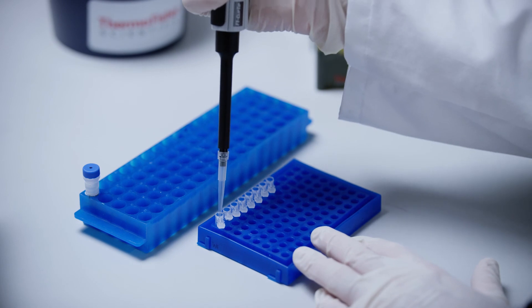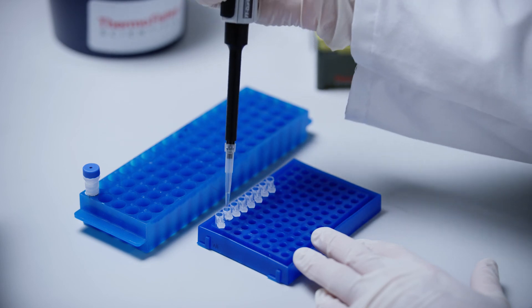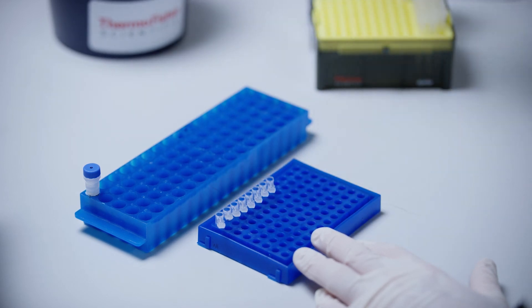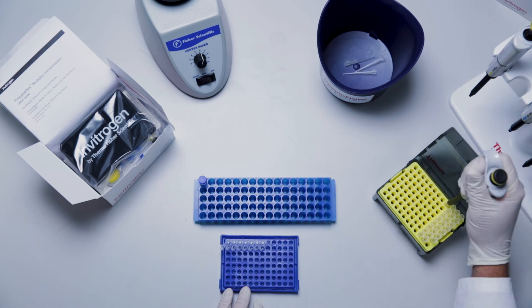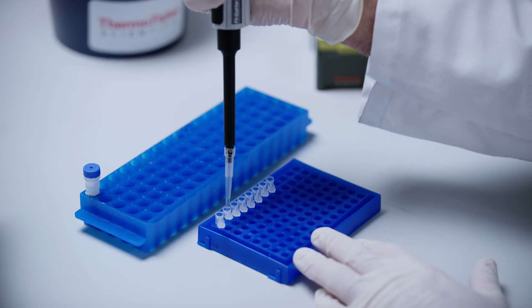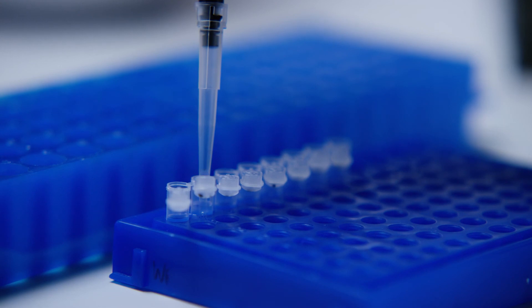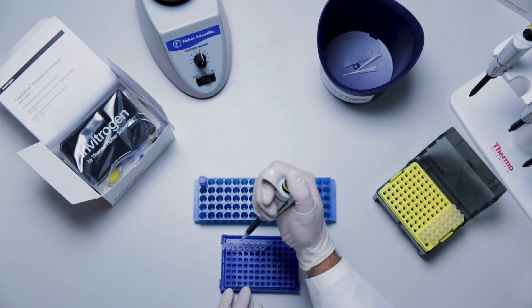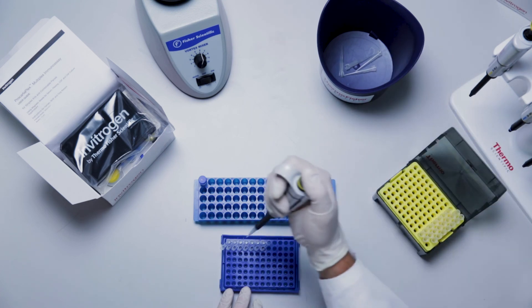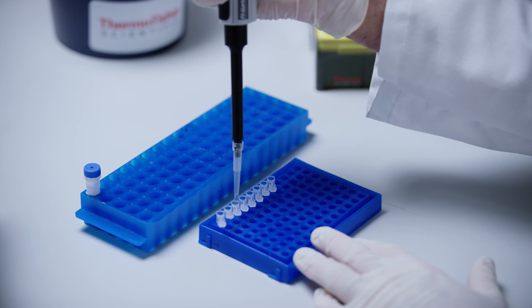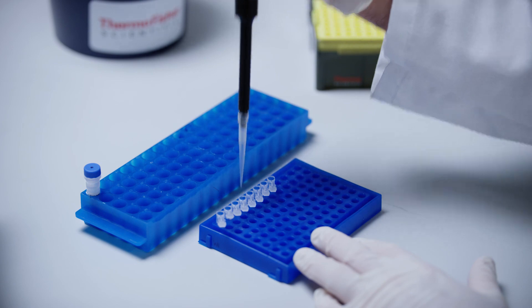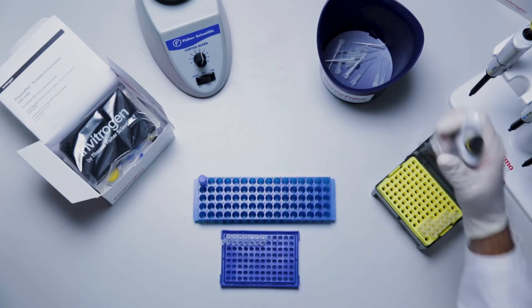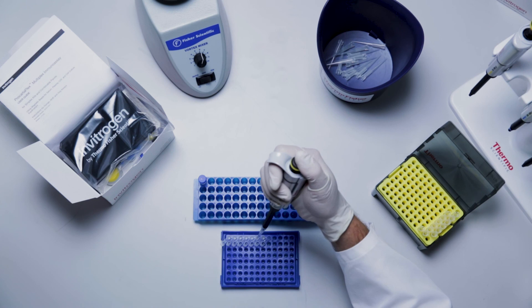Transfer 50 microliters of the mixed antigen standards from standard tube 1 into standard tube 2. Mix by pipetting up and down 10 times while changing tips between each tube. Transfer 50 microliters of the mixed antigen standard from standard tube 2 into standard tube 3. Mix by pipetting up and down 10 times. Transfer 50 microliters of the mixed antigen standard from standard tube 3 into standard tube 4 and mix by pipetting up and down 10 times. Repeat these steps for the tubes labeled standard 5 through standard 7.